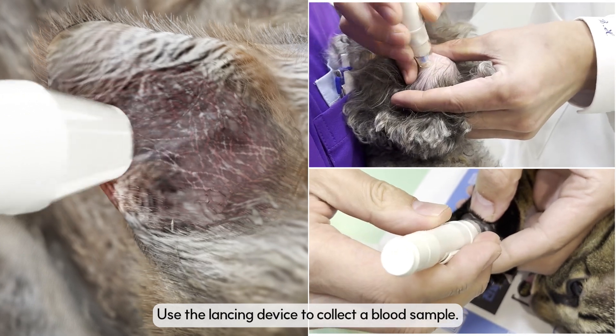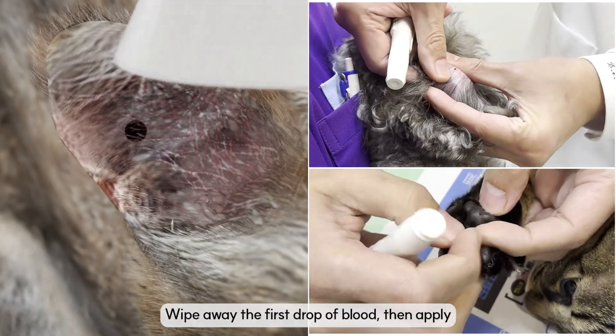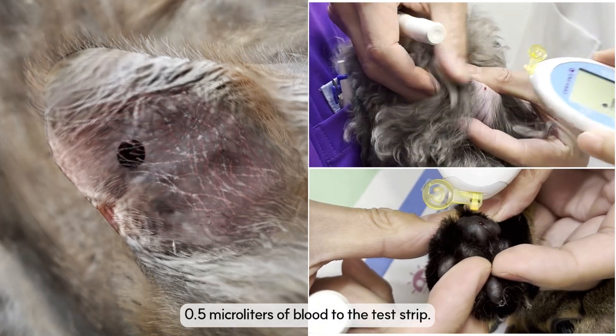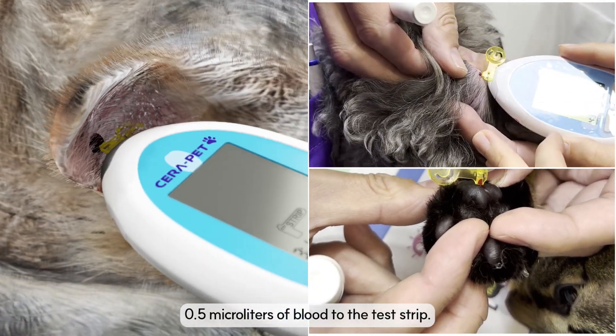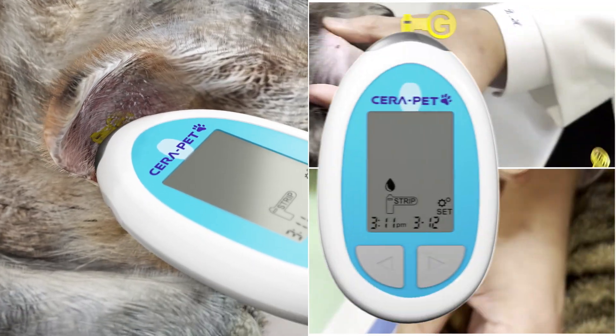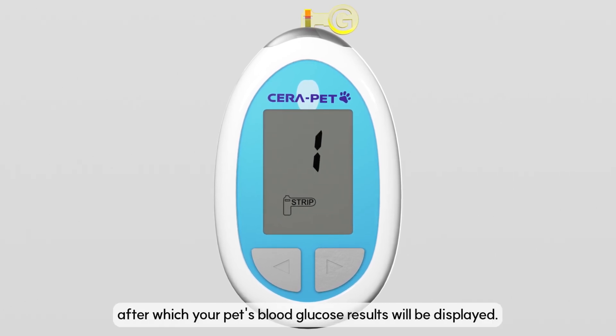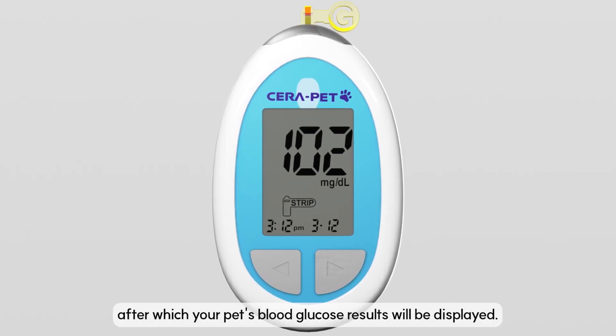Use the lancing device to collect a blood sample. Wipe away the first drop of blood, then apply 0.5 microliters of blood to the test strip. The meter will begin a 5-second countdown, after which your pet's blood glucose result will be displayed.